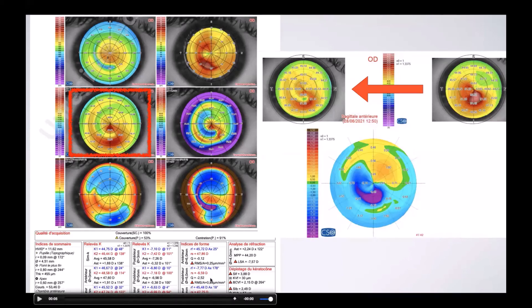You can see my mouse moving. Here in this part of the cornea, we see the posterior elevation of the ring.